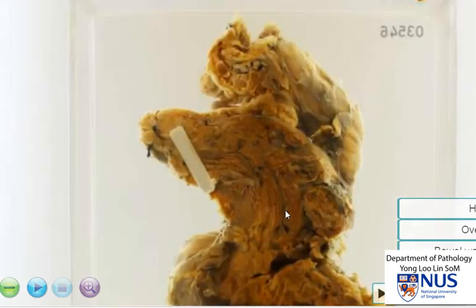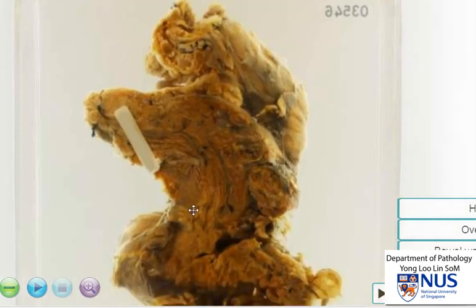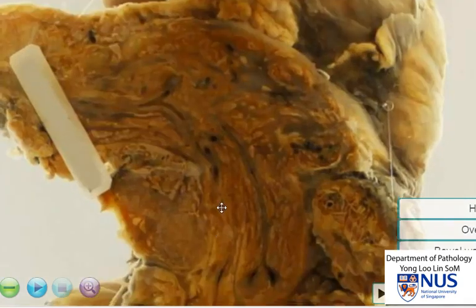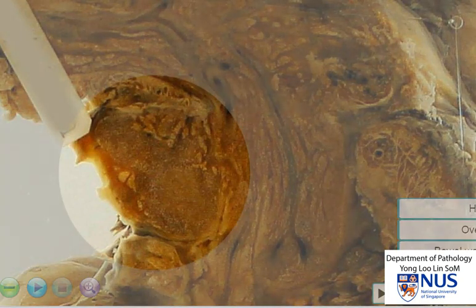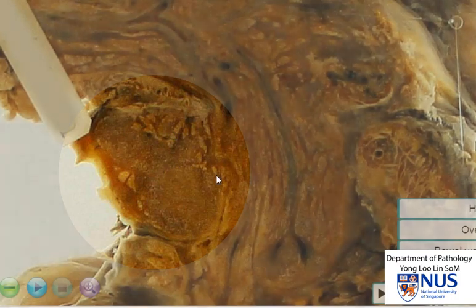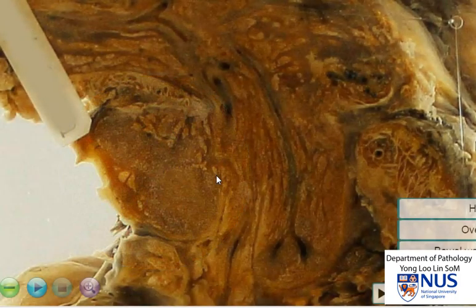Now let's have a look at the serosal surface. Sometimes, if we are fortunate, we will be able to see enlarged pericolic lymph nodes as well. In this instance, there is a suggestion that this mass here may represent enlarged lymph nodes. We could also look for caseous necrosis within these lymph nodes, which would also be involved by granulomatous inflammation.